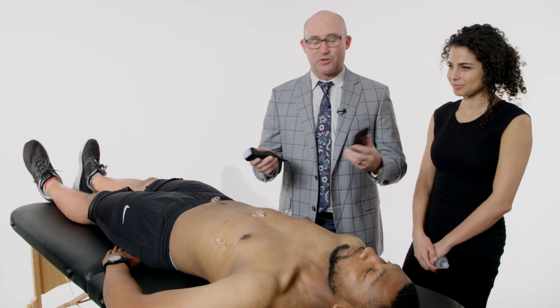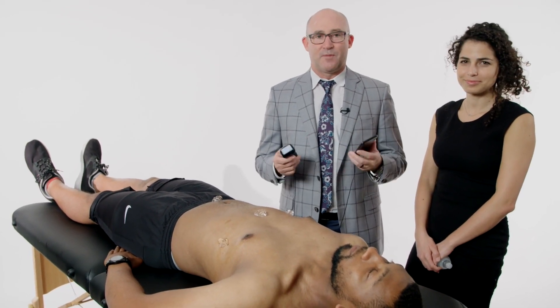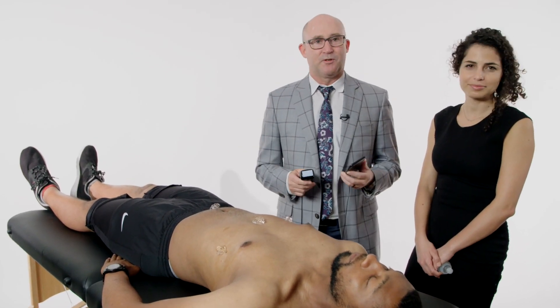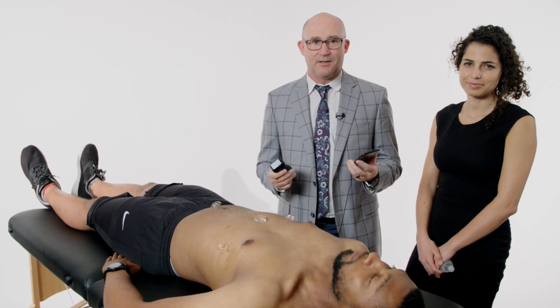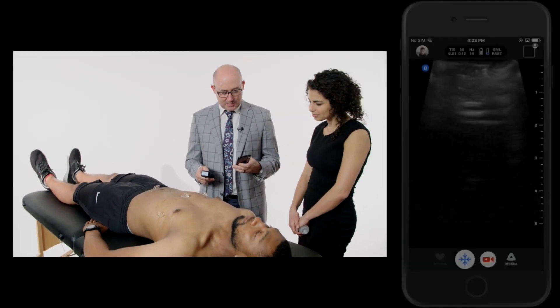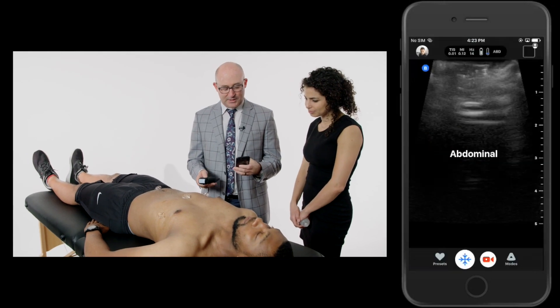I'd like to just do a kind of a survey here of my model's abdomen, chest, neck, and his popliteal fossa to show you that, indeed, it looks like you can do all three things. So I'll start here in the abdomen, and I'm going to go to presets and bring it to the abdominal preset.